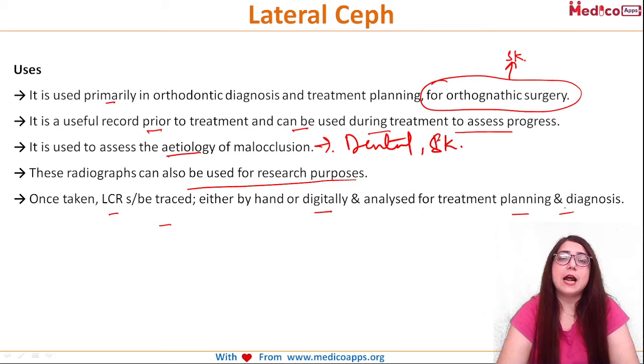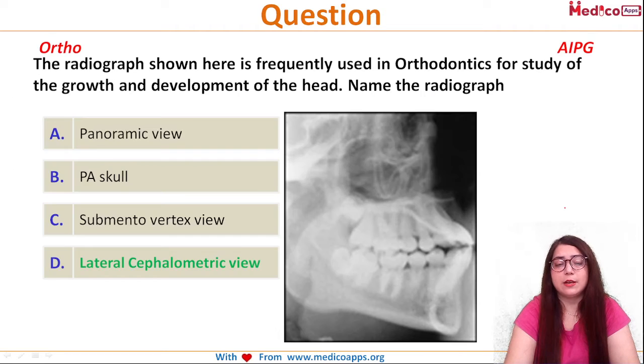So all these are about the lateral ceph. If you are pursuing ortho, you need to study more about lateral ceph, and even for oral medicine, you need to know the landmarks and for which conditions you are supposed to take a lateral ceph apart from the ortho department. All these are the uses of the lateral cephalogram.